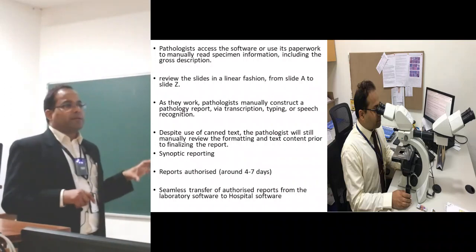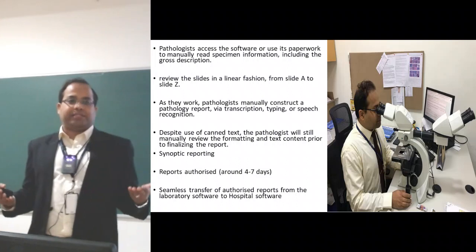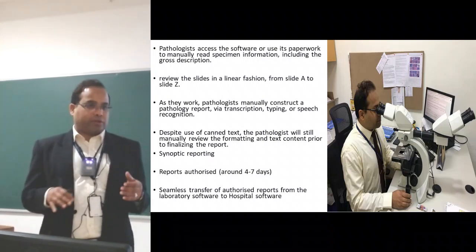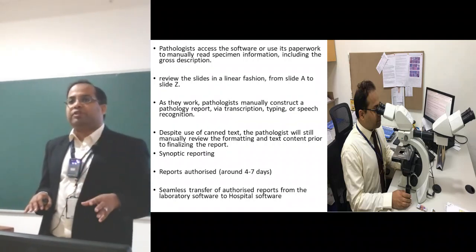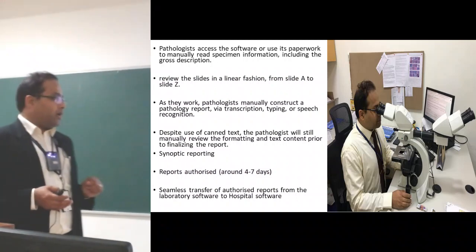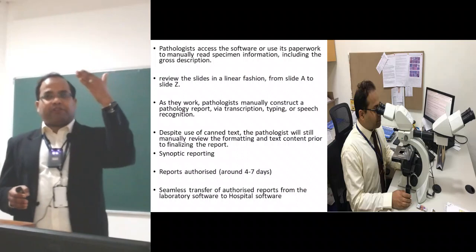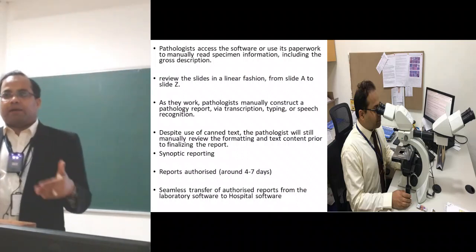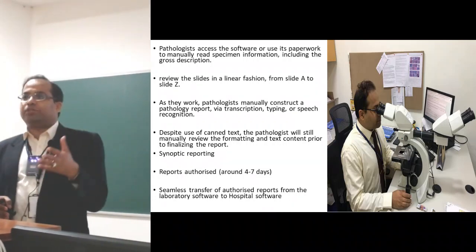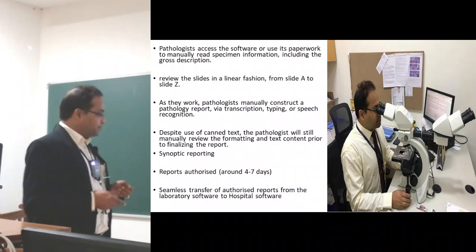We sometimes use what is called canned text, where we have a formatted report and we just have to fill in the blanks and authorize the report. But this is only for the routine specimens. Any deviation from the normal, they can't do. Synoptic reporting is like a form that you have to fill up, but sometimes the clinicians find it difficult to decipher the information they need for their clinical treatment purposes.